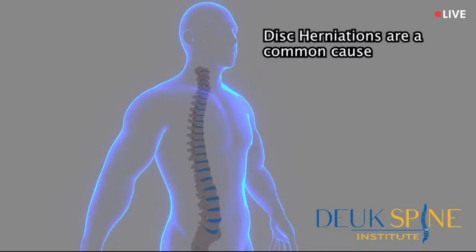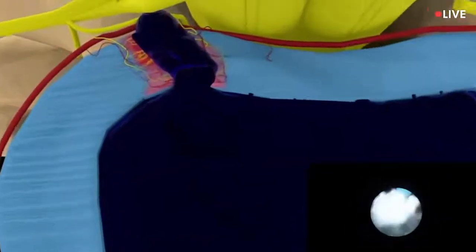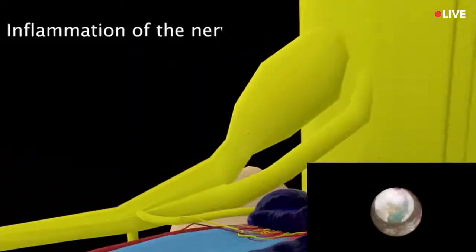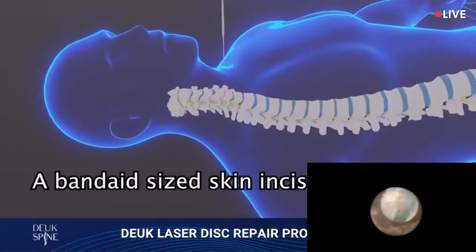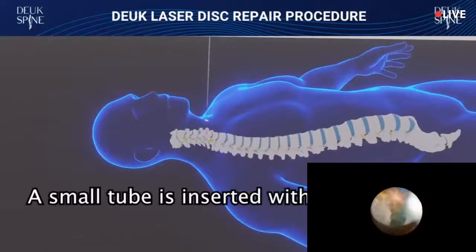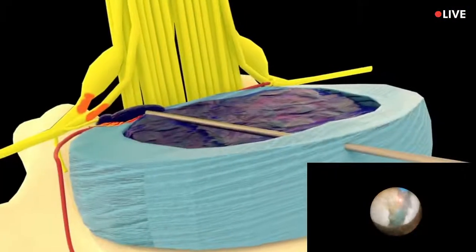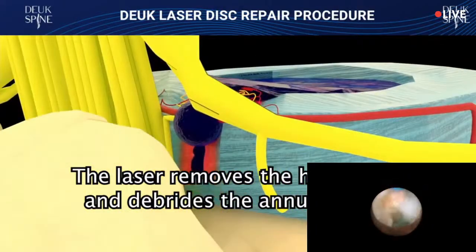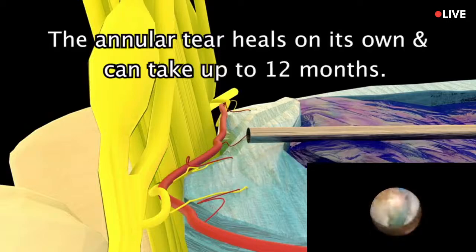Dr. Deuk: Disc herniation is a common cause of chronic neck pain. The inflamed annular tear causes neck pain. Inflammation of the nerve roots causes arm pain. A Band-Aid-sized skin incision is made. A small tube is inserted without damaging the bone or soft tissues. The laser removes the herniation and debrides the annular tear. The annular tear heals on its own. It can take up to 12 months.